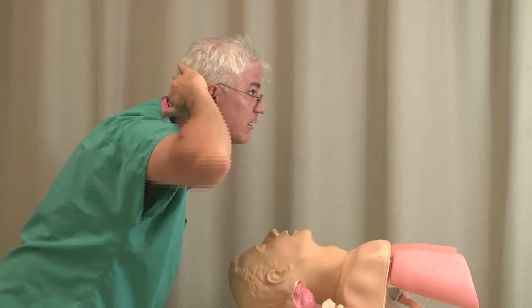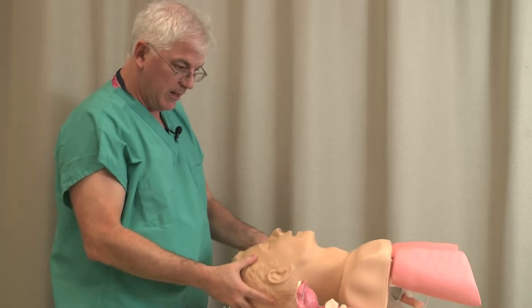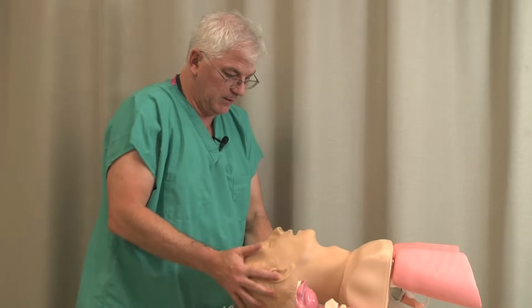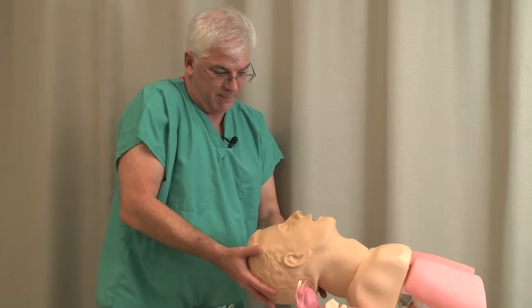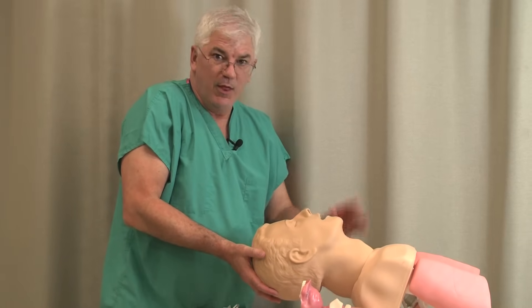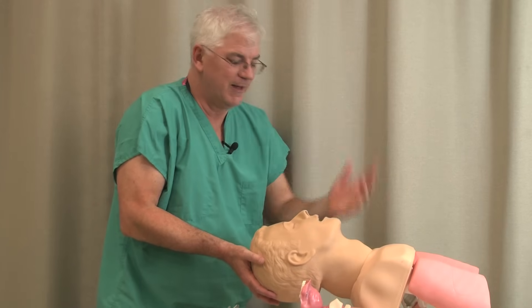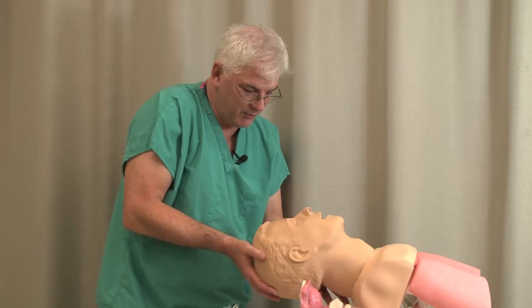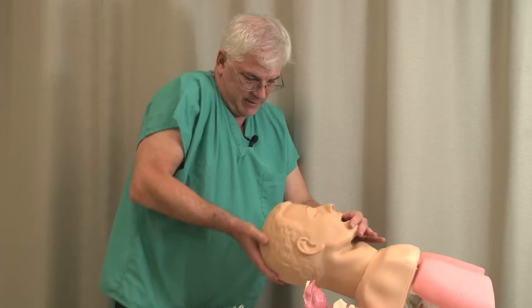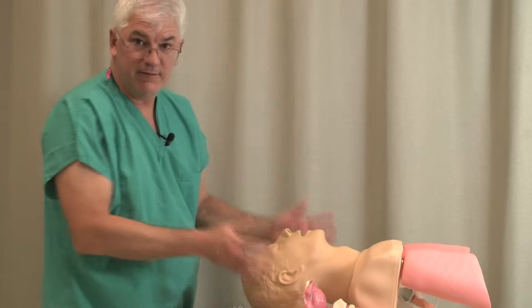My head is forward like that and you want to get them in a good position. A lot of times if people have a big BMI, you need to ramp them up — build up their shoulders. Whatever you have to do ahead of time to get their head in a good position: the better the head position, the less skilled you have to be at laryngoscopy. You want to have everything working for you. Head position — very, very key thing.